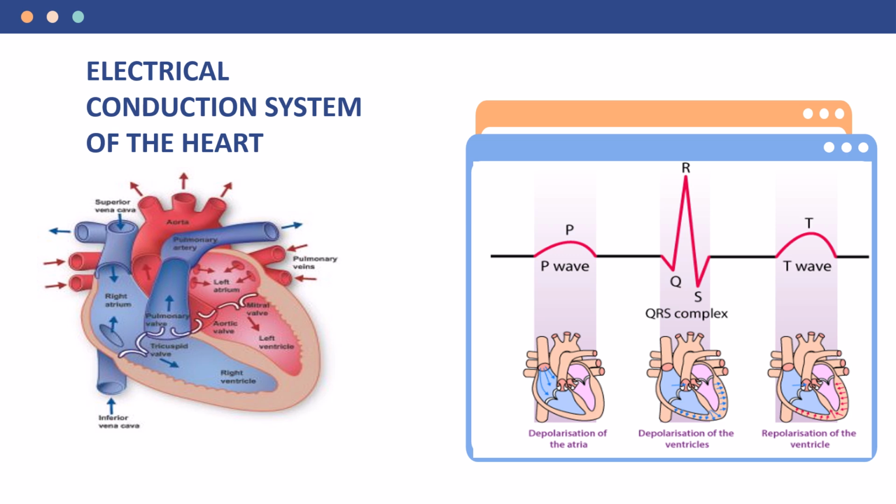Now, this is a little bit more advanced. Why? Because what does it mean? So, what does your P wave mean? We will discuss it in the later slides. P wave means depolarization of the atria. Let it be in your mind very clear that depolarization means, very simply, the contraction of the atria. Your atria is contracting after receiving the electrical impulse, okay, from the SA node.